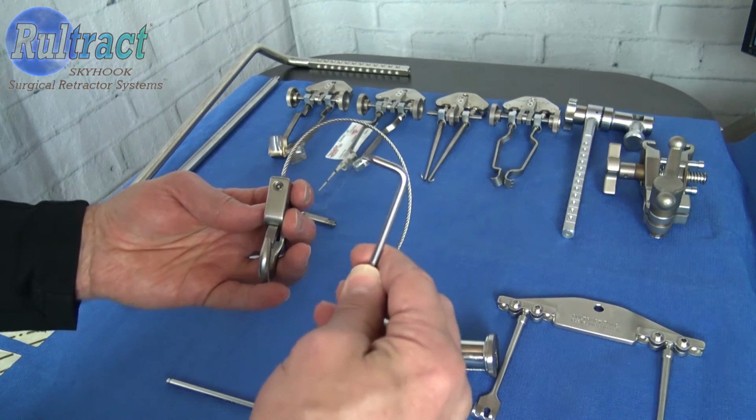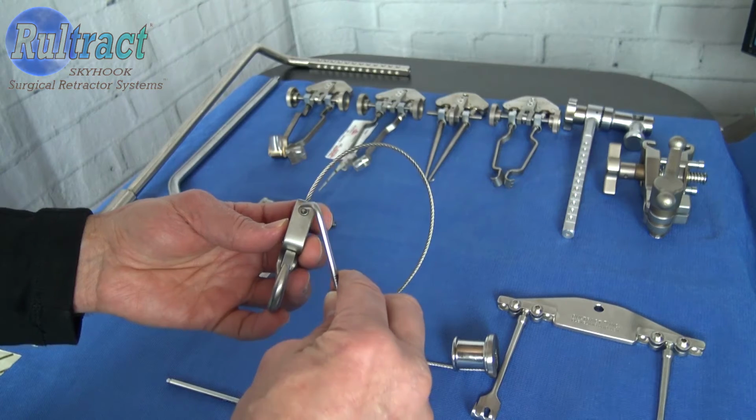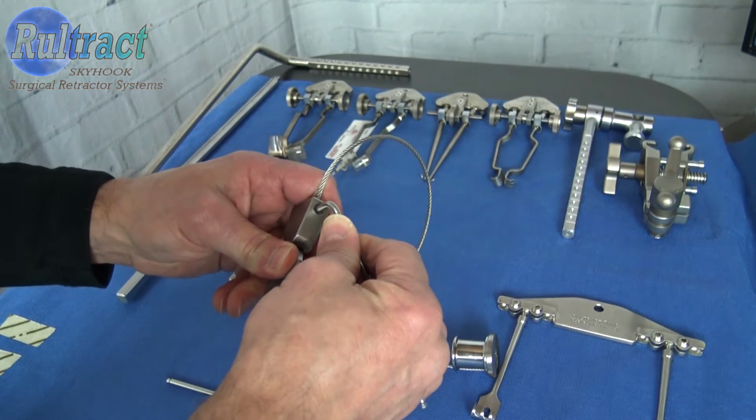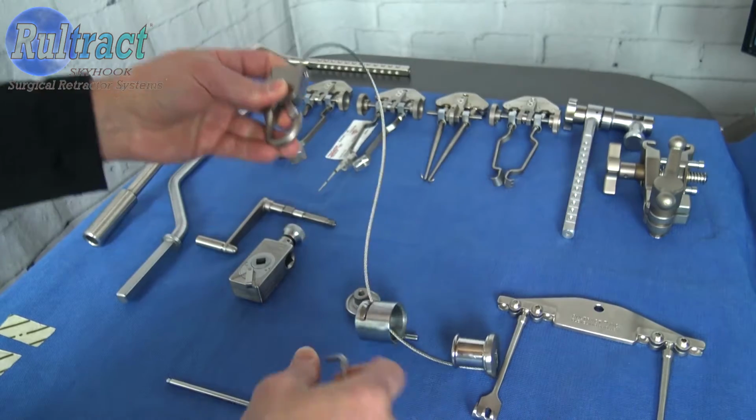Next, you're going to use your small Allen wrench to check your cable set screw. You don't have to over tighten this, just make sure that it's tight and secure.